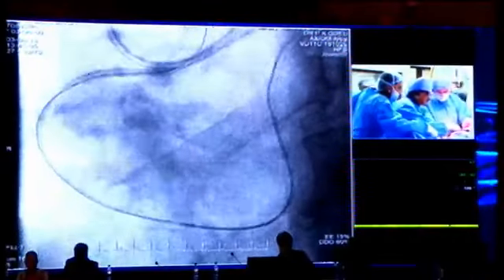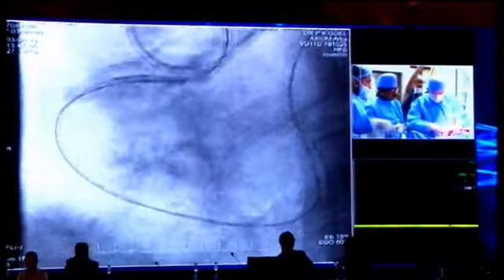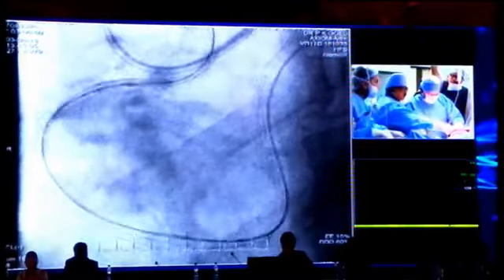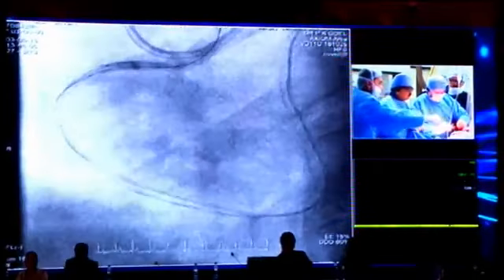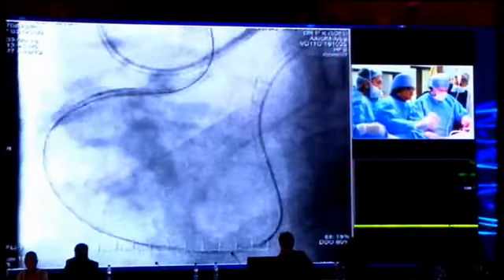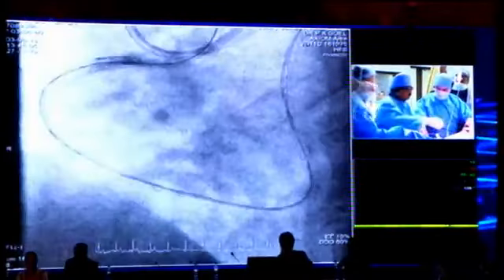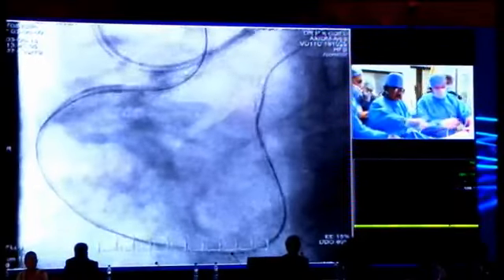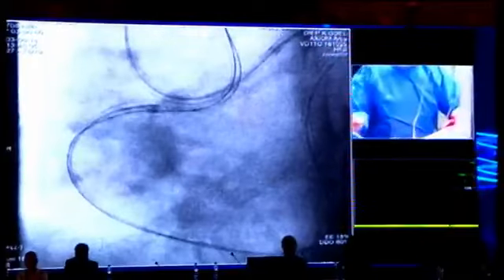Let's get the balloon out. You just see everything is okay when you're getting it out. You will need to pull this out for a moment. Okay. No, we have everything out now. Just a sec. Sure. Yeah, there is the RG3. Okay. Now you need to get all the wires out. So there's the RG3. It's going to come away. It's bleeding, okay. But this is straightforward.